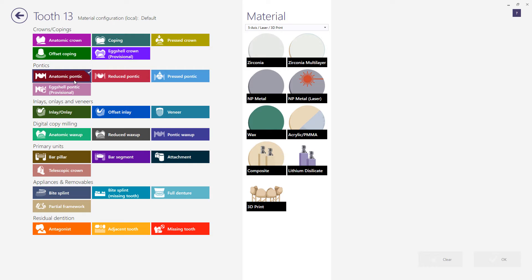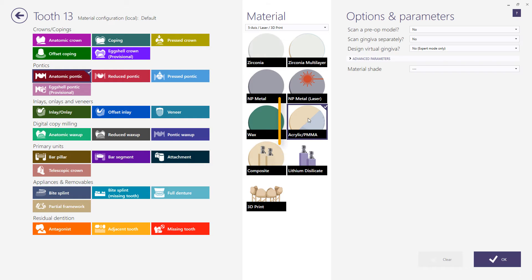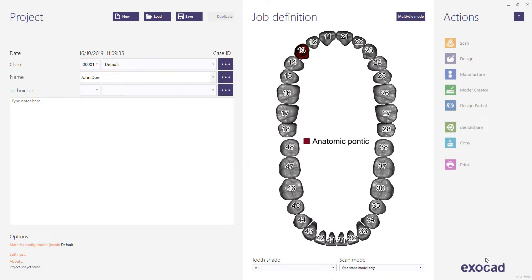Choose your desired material. In this case, we're choosing acrylic. Finish the restoration definition by clicking the OK button.